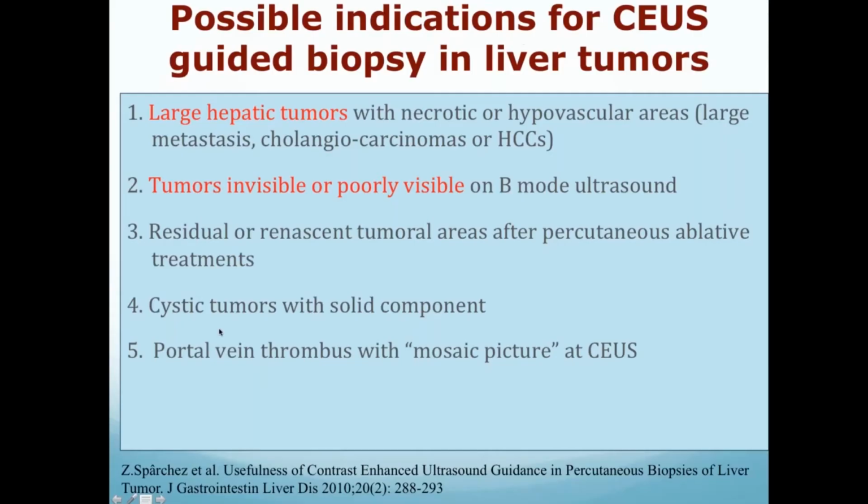So these could be possible indications, besides these large tumors that are invisible or poorly visible: residual or renascent tumoral areas after ablations, or cystic tumors with solid components, or portal vein thrombosis.